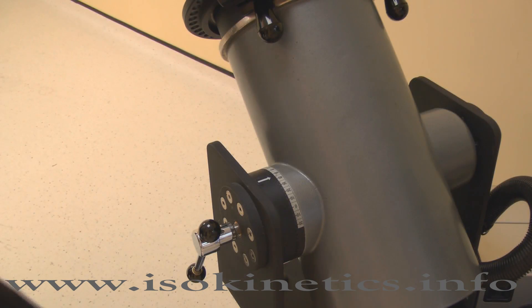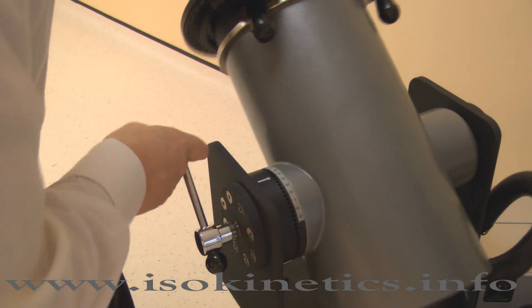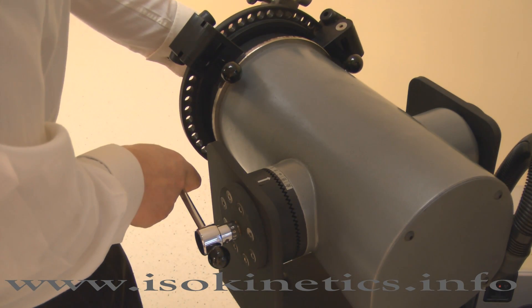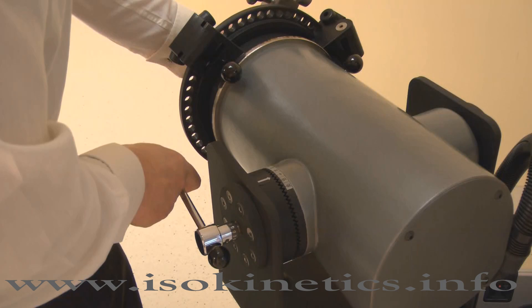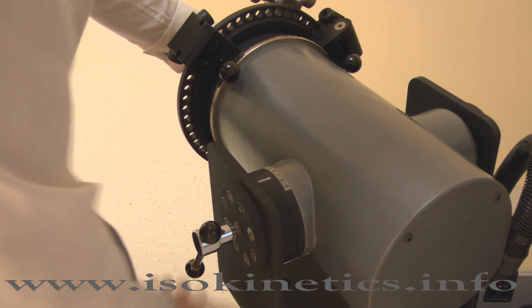Set the dynamometer tilt. Release the locking handle then change. Adjust the tilt angle to zero degrees. Lock by tightening the handle.